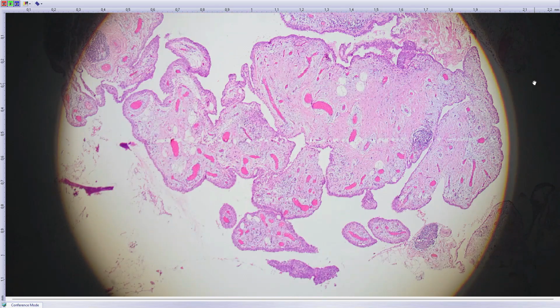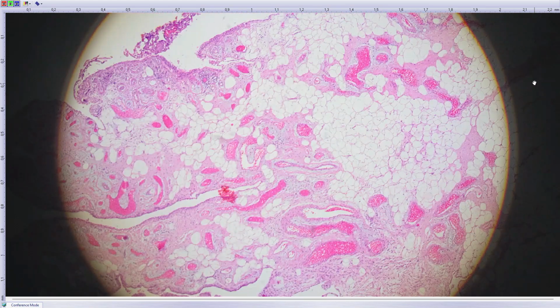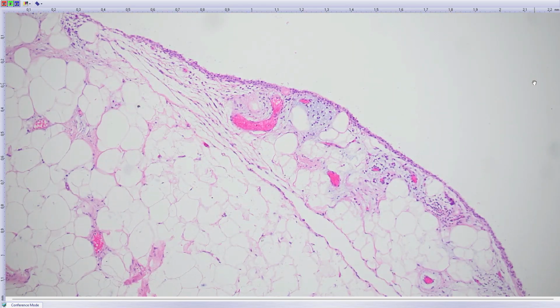Nobody knows why. So sometimes, when you have a synovial frond with some fat cells, it's hard to say what's enough for this diagnosis and what's not. So there is no cutoff, of course. It's impossible to make a cutoff for that, but this is so much that this is clearly abnormal. So lipoma arborescens. Often you have this myxoid material there as well.